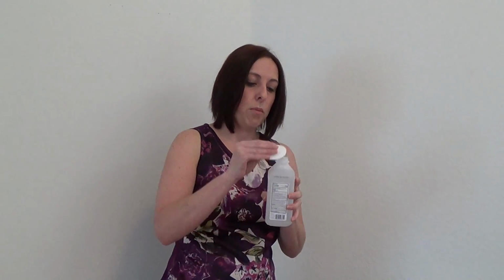To use the pen, you want to make sure that you wash your hands with soap and water, which I've previously done, and then you want to clean the injection site with alcohol. You can inject the insulin on your upper arm, your thighs, or your abdomen. If you use your abdomen to inject the insulin, make sure you stay 2 inches away from the navel.